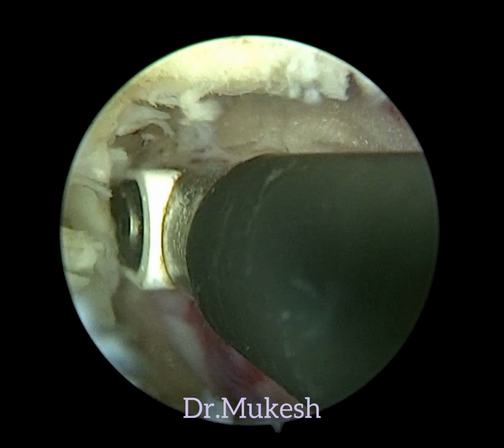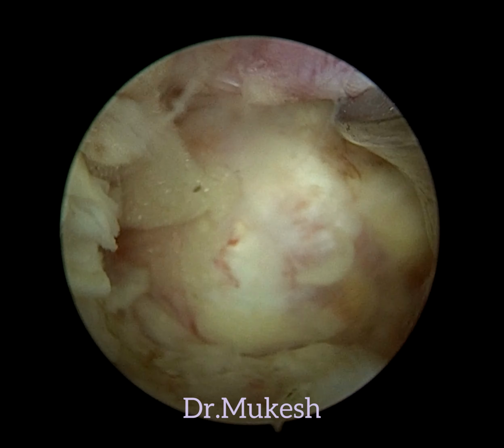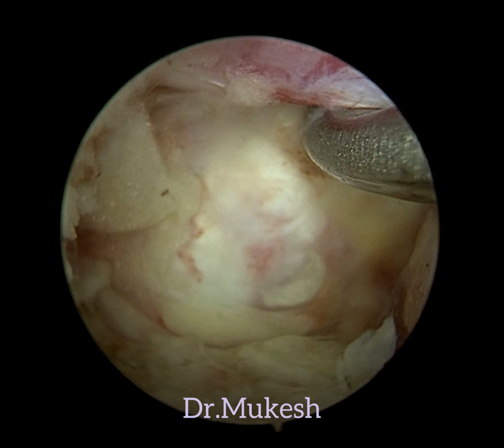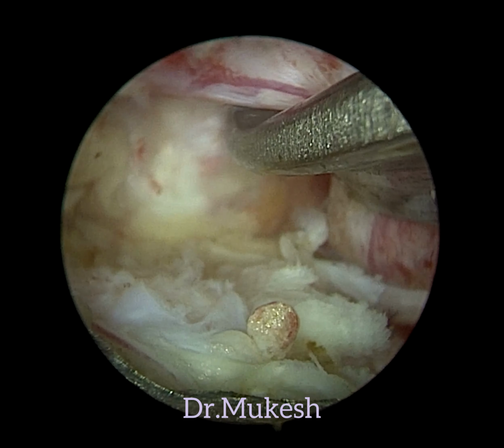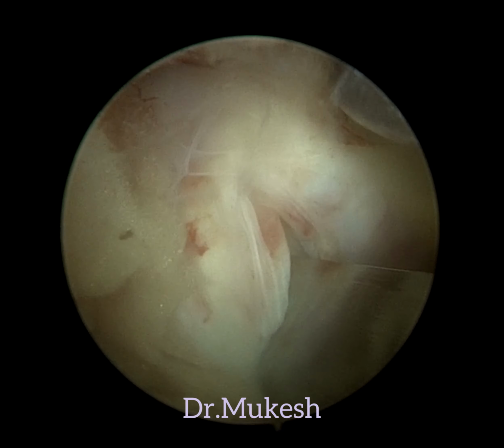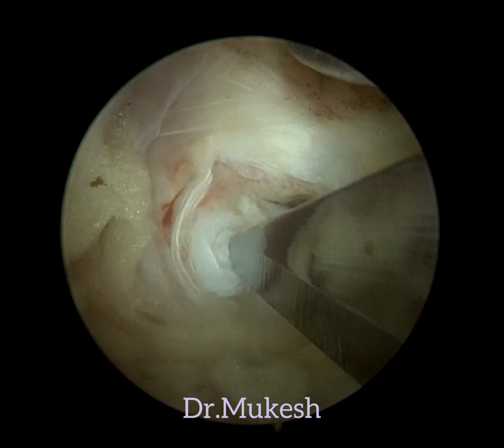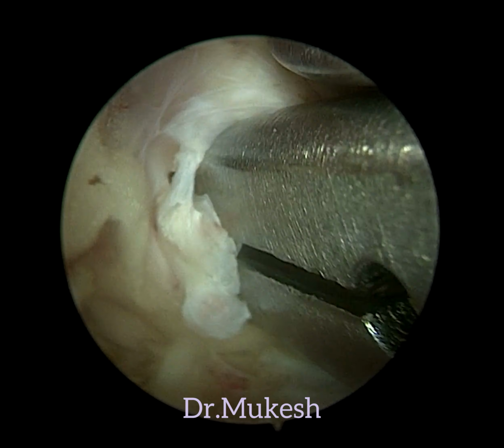So this is axilla and traversing root. So we can see there is lot of adhesions, lot of new vascularization because of this disc bulge. So disc is there. So discectomy is performed in a regular way.